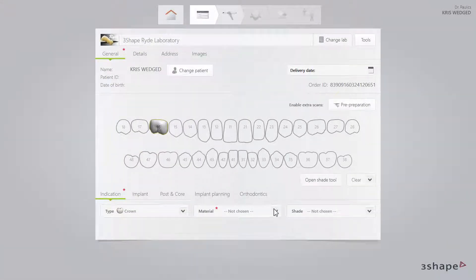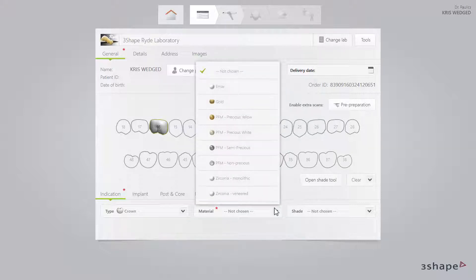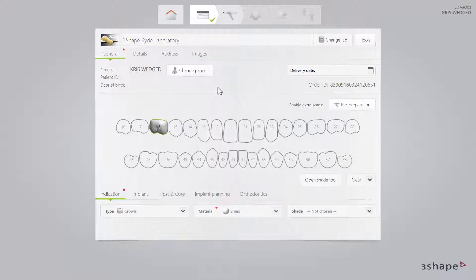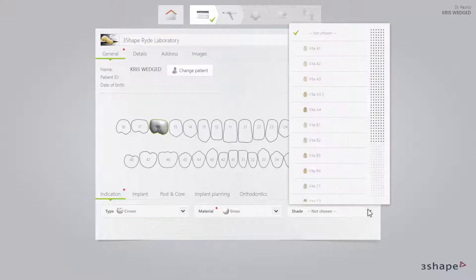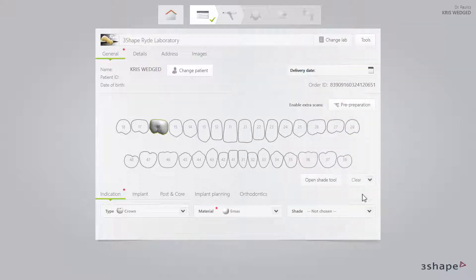Then select Material in the Material drop-down list. If you have a pre-determined shade, select it in the Shade drop-down list. Finally, set the delivery date by clicking the Delivery Date button.